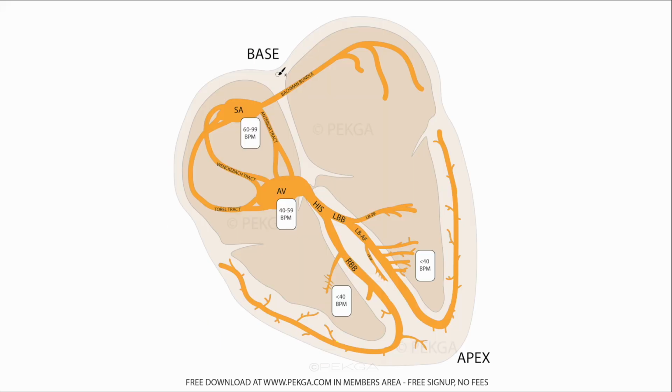Okay, so let's see here. Where was I? Oh yeah, lead 2. Okay, so going back to why we use lead 2. Lead 2 corresponds to the major axis of depolarization in the heart. When I say major axis, I mean the signal originates, or it's supposed to, in the sinoatrial node, and it travels down the heart, right, all the way down to the apex. Lead 2 mimics this path. That's why lead 2 is most commonly used.